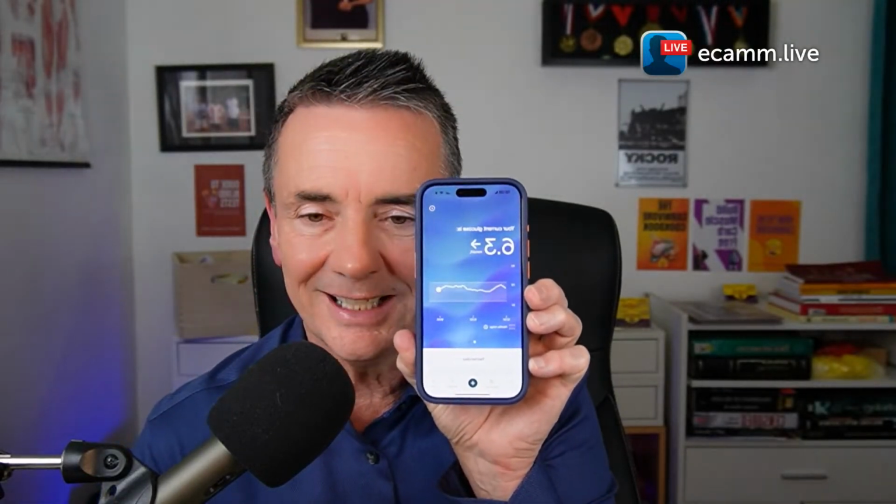Now, why is this important? Because people put too much importance on just those numbers. I have actually eaten something to see whether it's going to bring my blood glucose up or down over the next 20 minutes. We'll be interested to see. I will certainly be interested to see whether that happens. So it's been sort of a bit higher. It's been running at about 110 milligrams per decilitre all day.